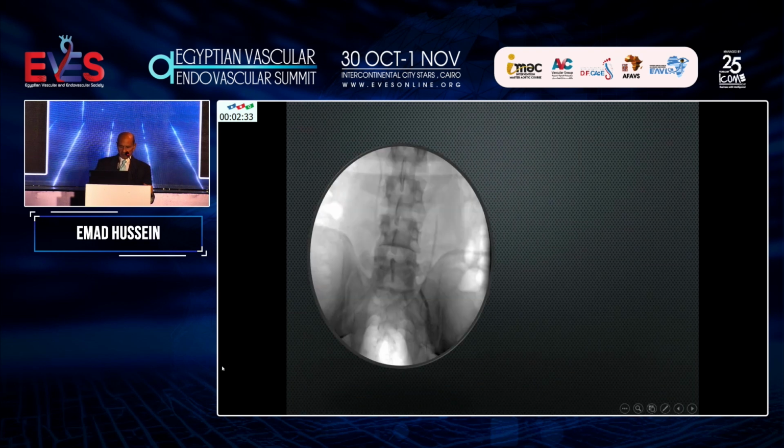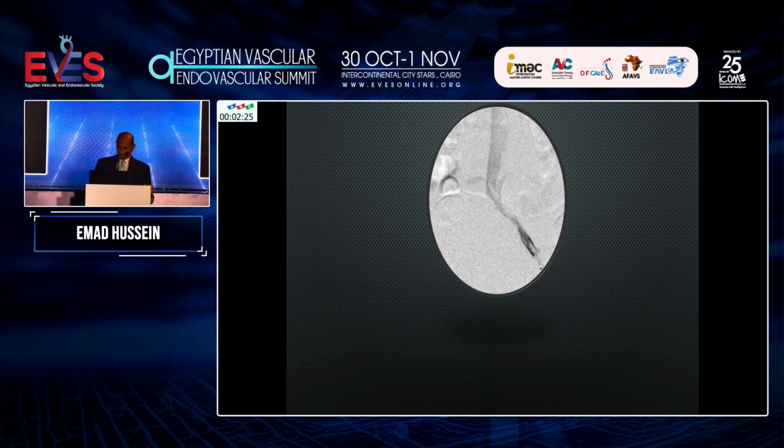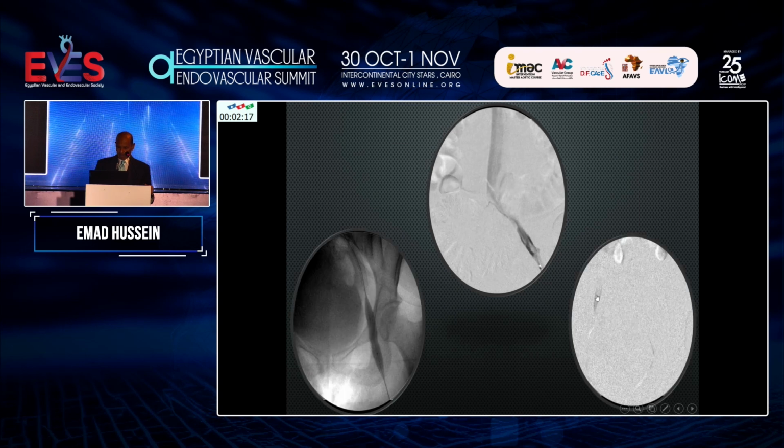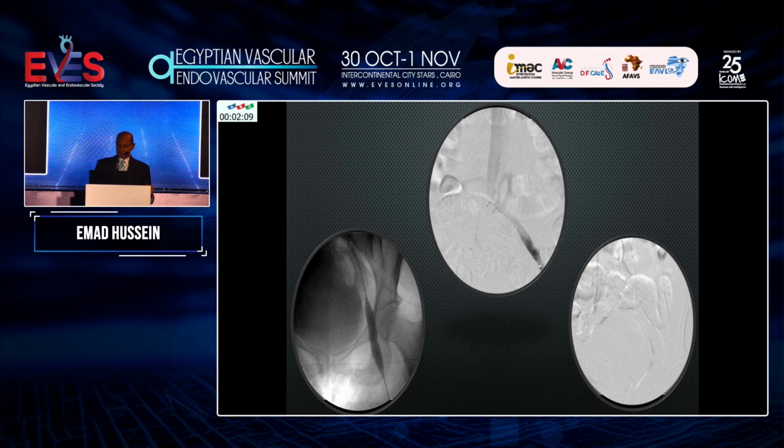Of course, I'll go quickly through this. Some of our cases, pre and post, and this is the final result, and after CDT and stenting as well.